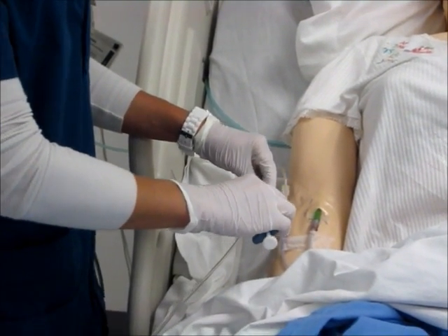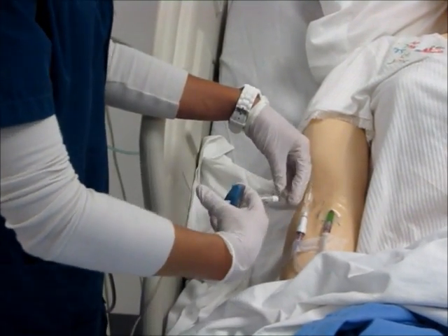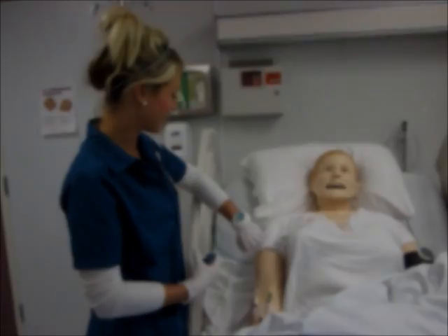Either with a saline lock or with a running IV infusion, as long as there were no complications with the flush, the nurse will then attach the medication syringe to the IV port and administer the medication at the identified rate. The nurse will monitor the patient's response to the medication while administering.